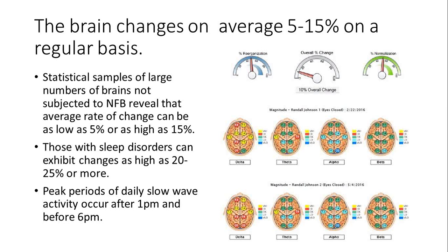Well, because as you get into the afternoon, you will find that there's circadian effects. There's a big dip between 3 and 5, but that window can shift depending on what time you go to bed. It may be earlier, 1 or 2, and 3 or 4 in the afternoon, or it may be later, between 4 and 6 or 7. Again, it depends upon your individual circadian cycles, but that's roughly it.